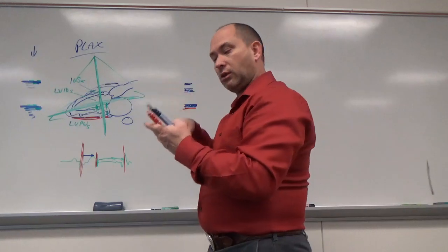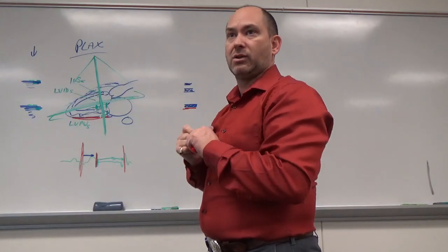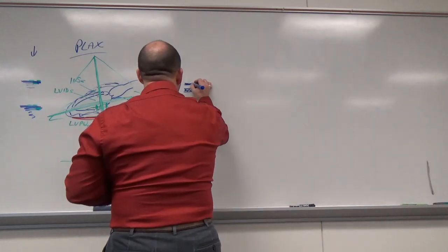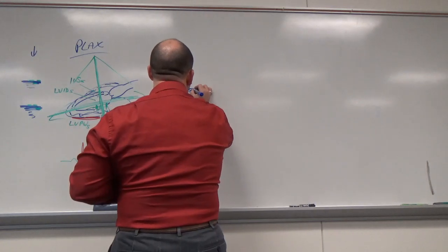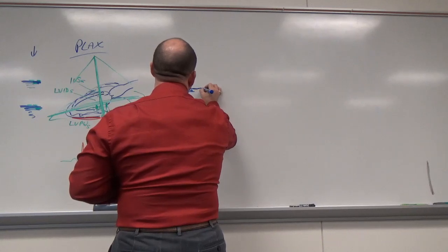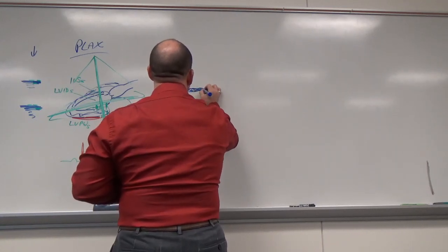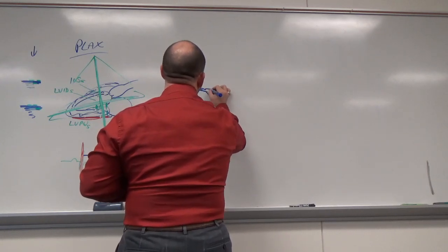Now I'm going to be dragging it over time. So what happens to the ventricles as I go from diastole to systole? They're going to change. First of all, you get the idea on the RV. I'm just going to leave that the way it is. It would go all the way across. What I'm going to do here is draw what it actually looks like. It goes into there, and then it goes like this.